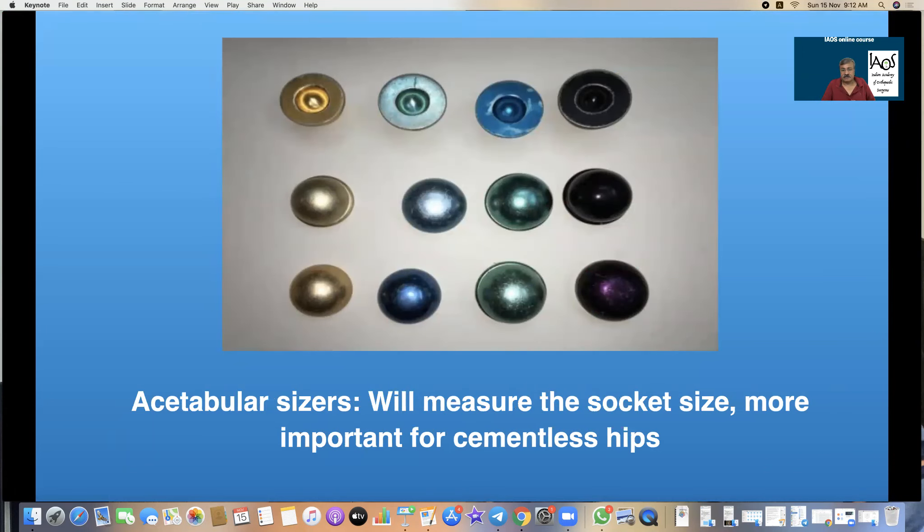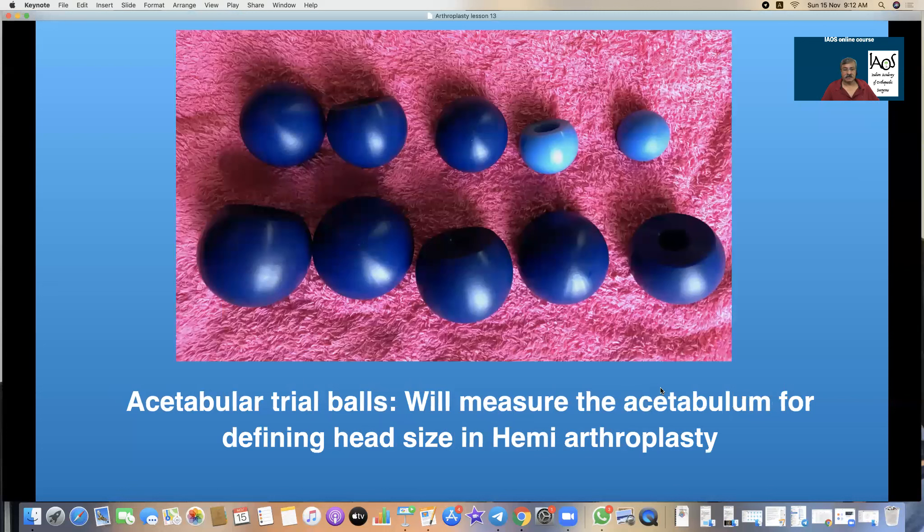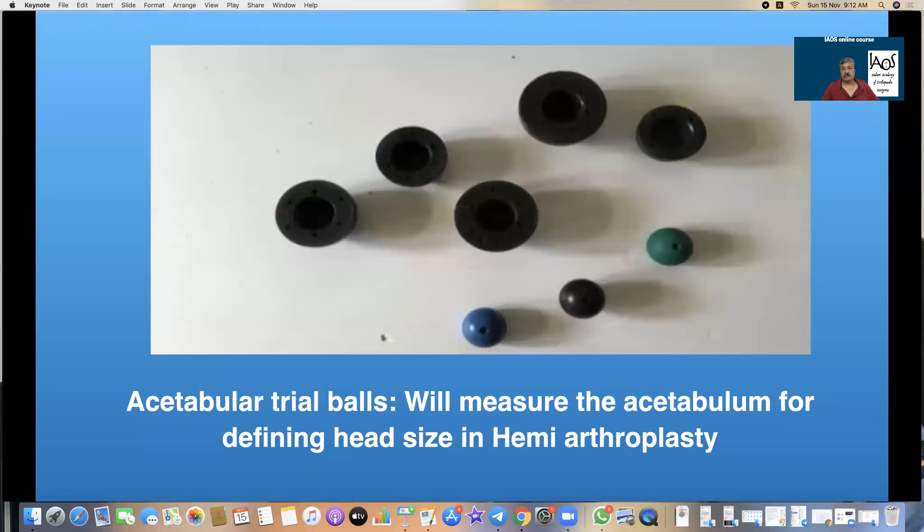These are the acetabular sizers. They come in various materials and colors which each company has made. This was my design made many years ago to measure the diameter of the acetabulum. These are the acetabular trial balls which I introduced for doing a trial reduction of a hanging head. These go on the rasps and a trial reduction can be done. These are the acetabular trials and head balls for trials, so for doing a trial reduction both must be seated on the prosthesis.